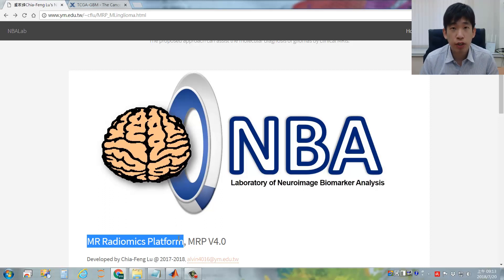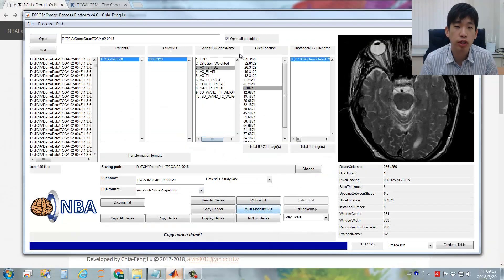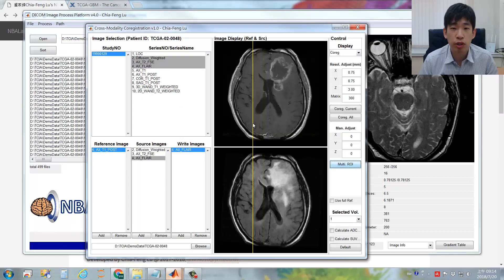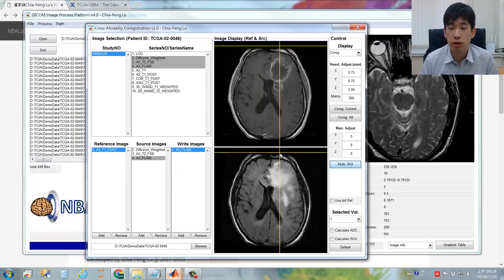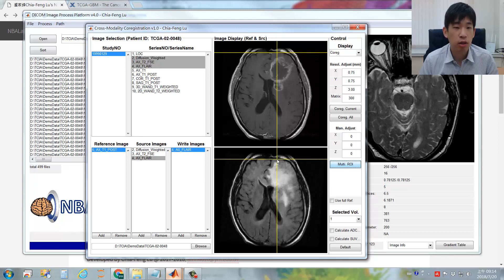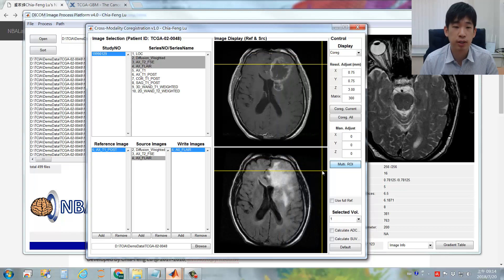In the previous videos, I have already showed you how to import the serial DICOM images into this platform, followed by performing imaging co-registration between different imaging contrasts. Now, once the imaging co-registration is done, we are ready to perform the multimodality ROI process.